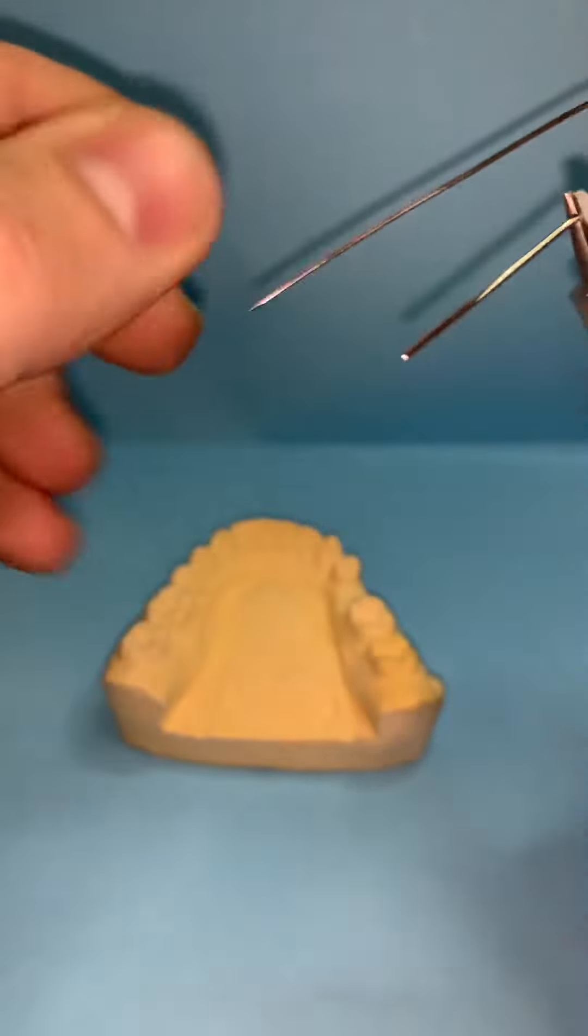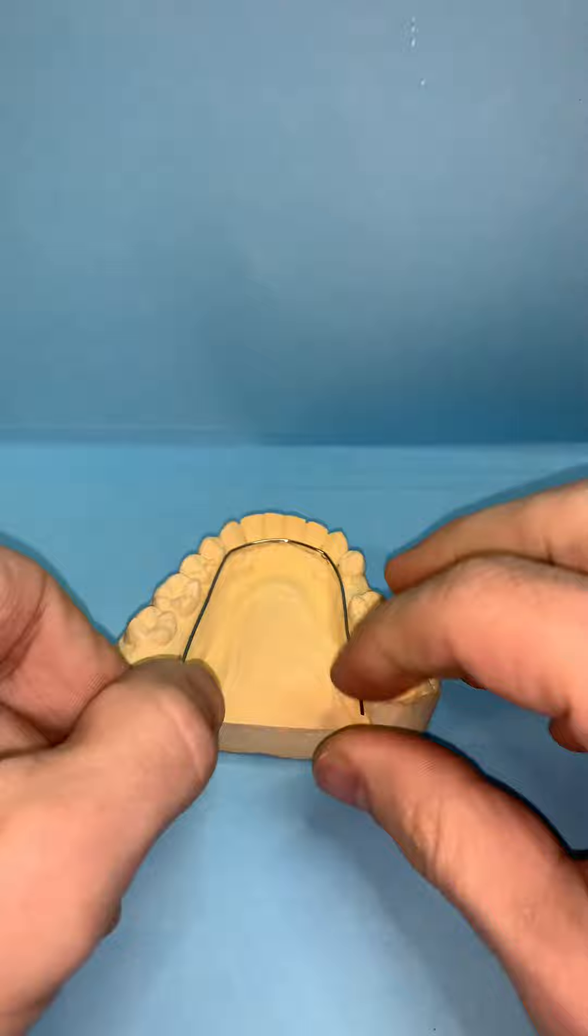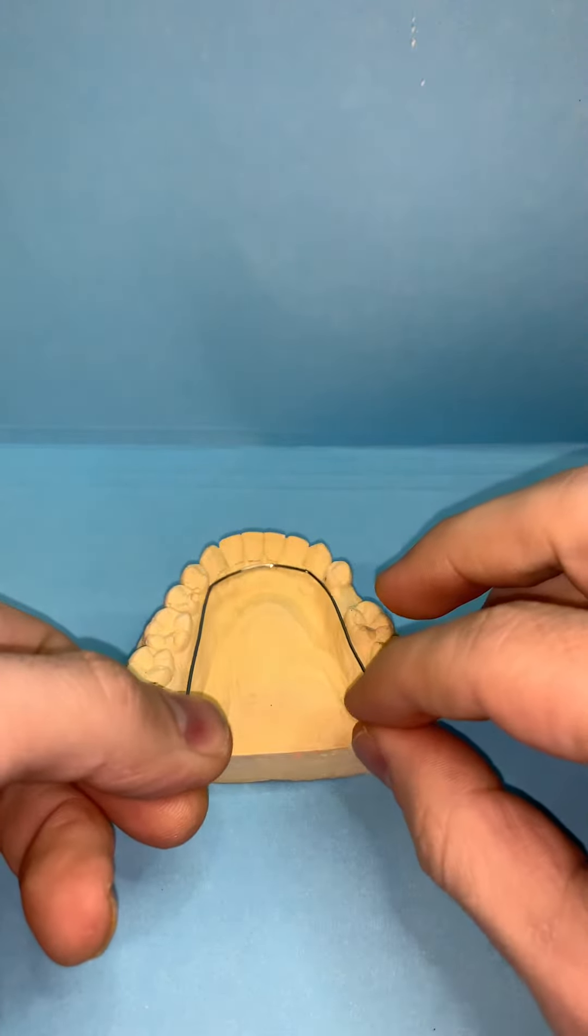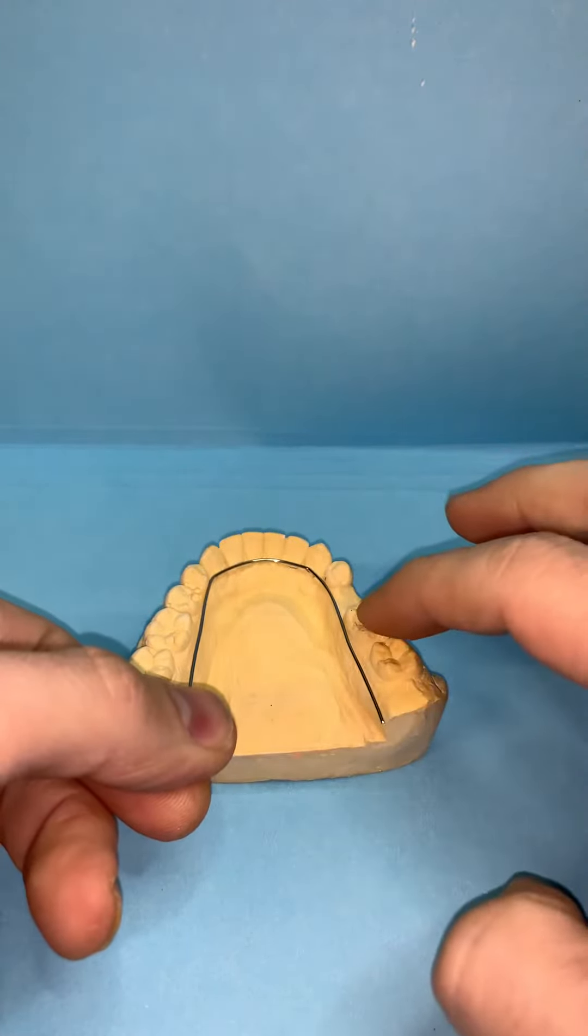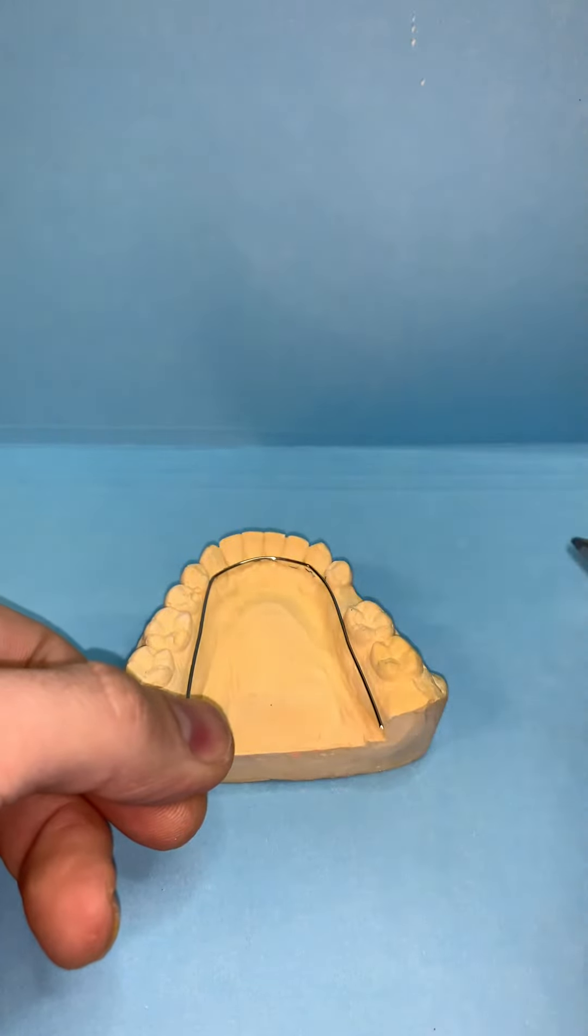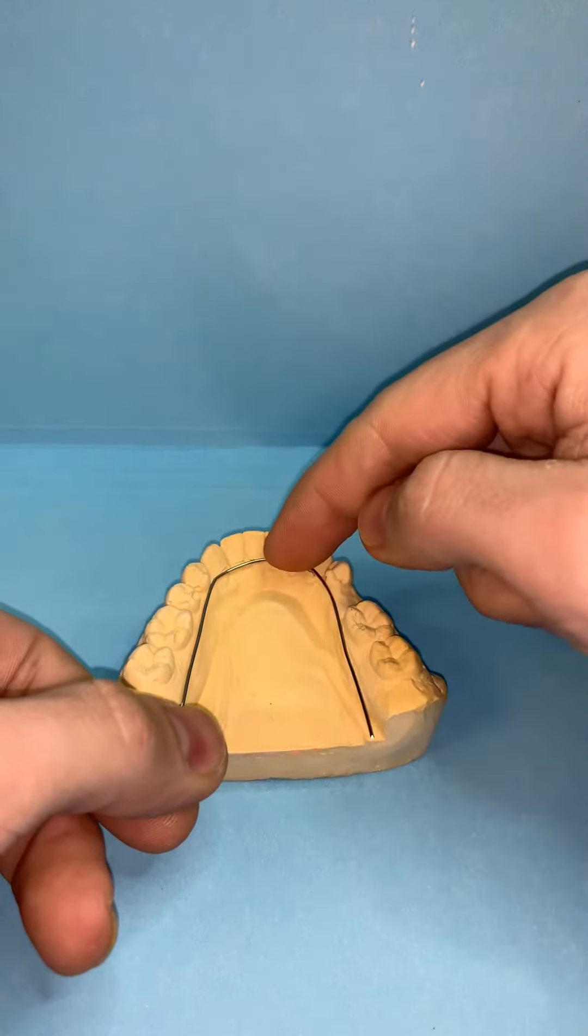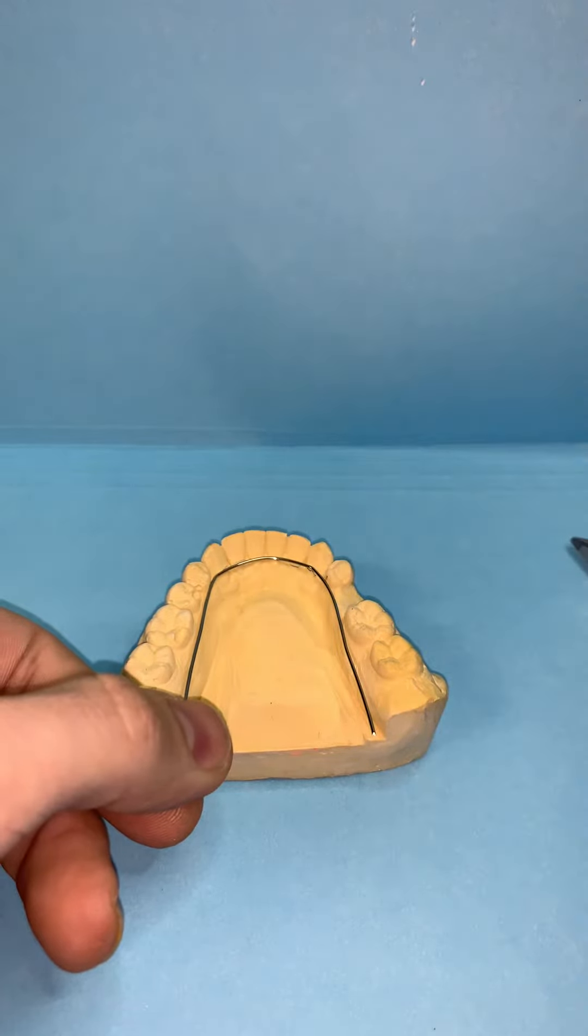And then you want it to finish into the middle of the band. So when the teeth are banded, we will fit it in the middle of the molars, band it, and then solder it. Very simply, that is your lower lingual holding arch.